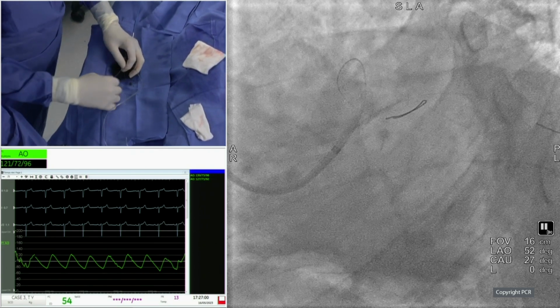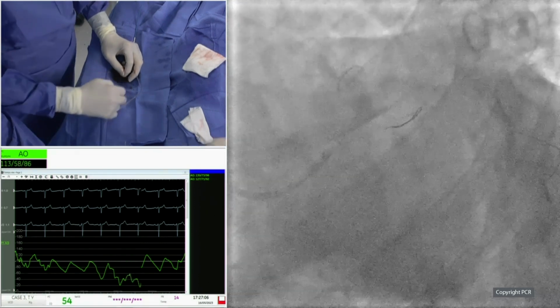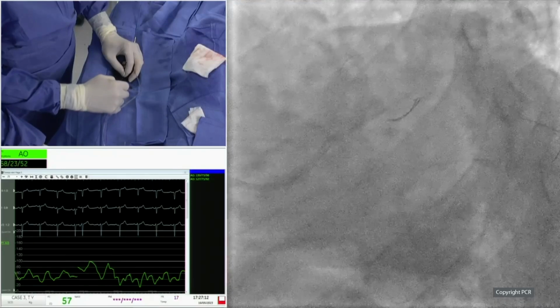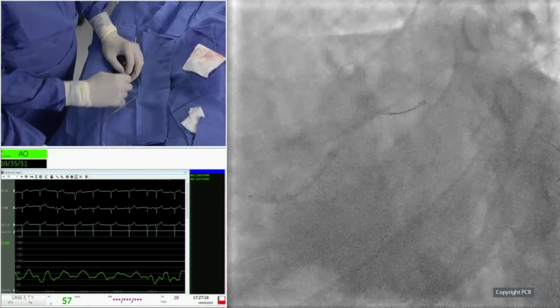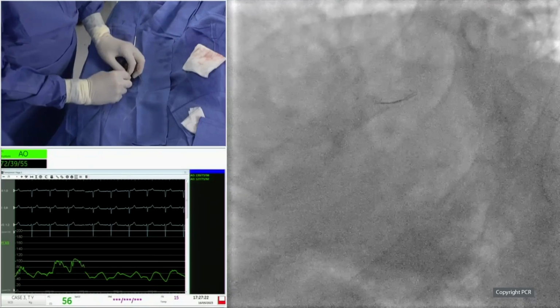So we are looking very carefully now to the ostium of the circ. But there it will not be so bad. There is no worsening after the stenting. We have approximately the same aspect as after the shockwave balloon. So in fact, the stent was quite conservative on this image. And now the next step is to do the pot with the 4.5-12 millimeter balloon.